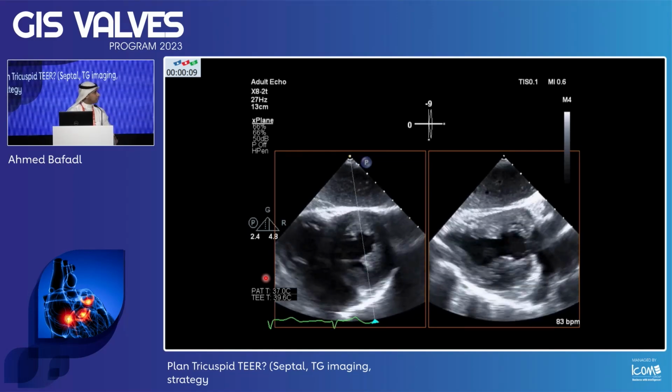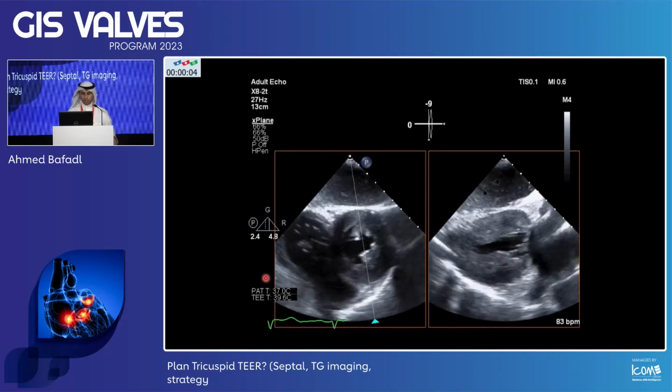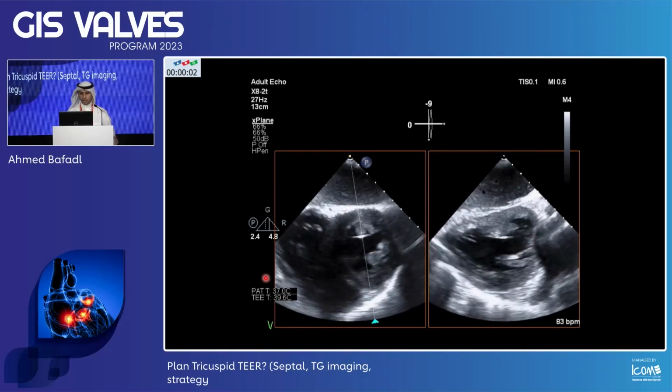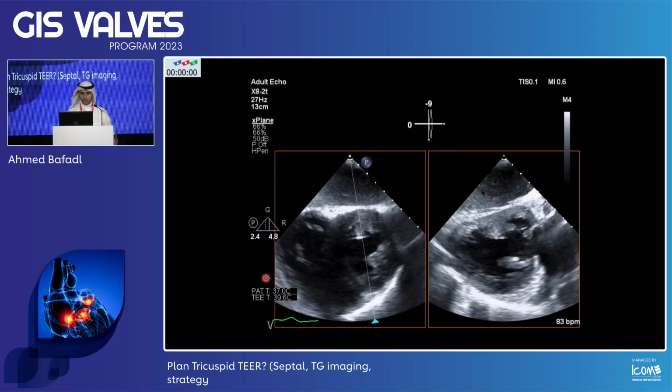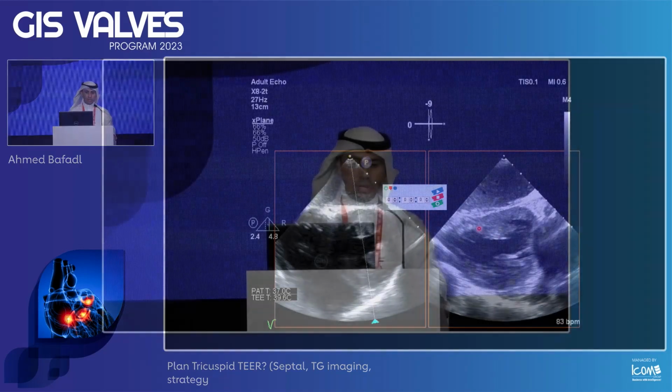Now, the slides are going to cut off. Be prepared, please. So, last few images, we go to the transgastric here to see the left side. Okay, so let's play it. Can we have 2 minutes, please? Yeah, 2 minutes. We're going to finish here.